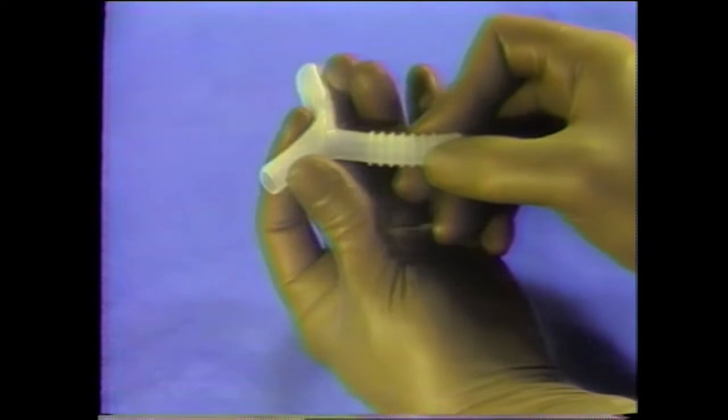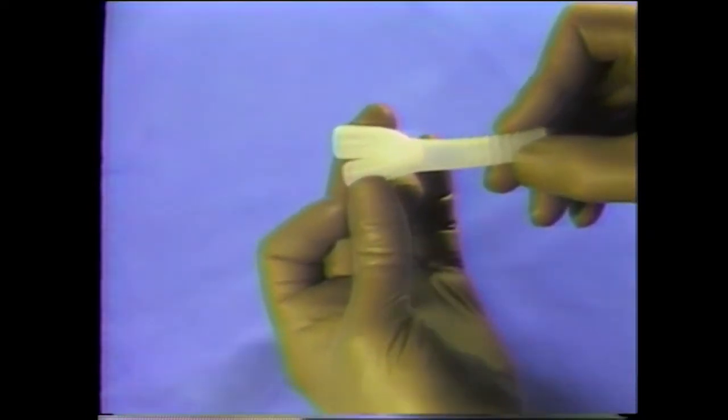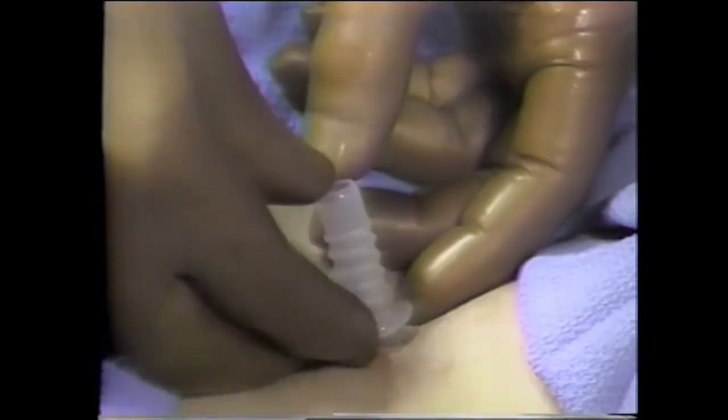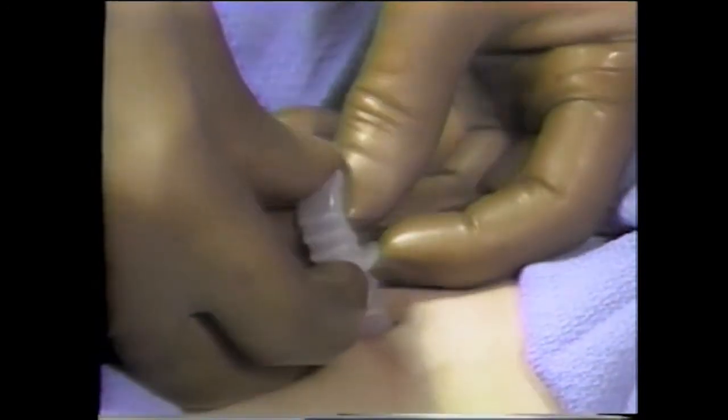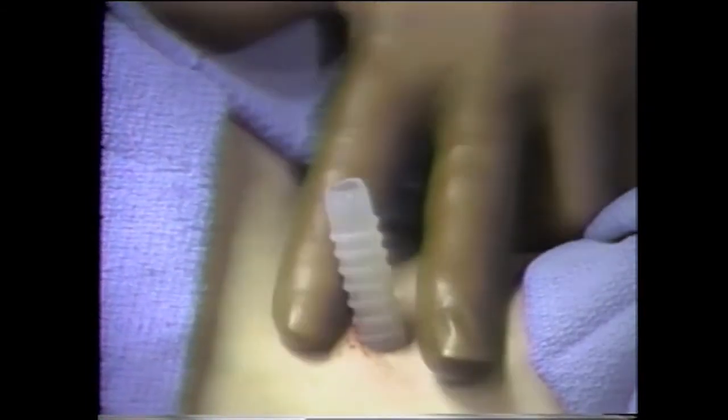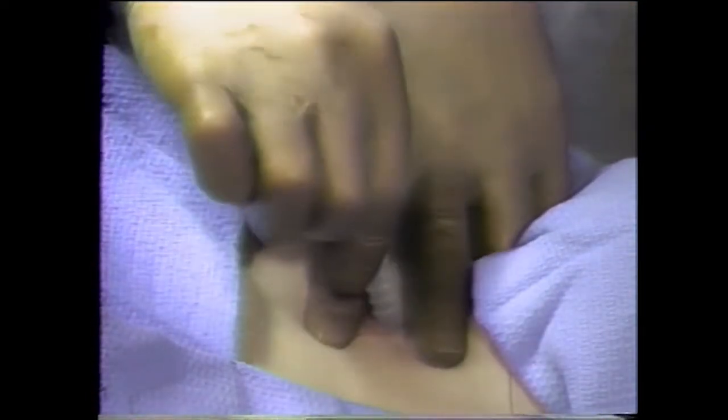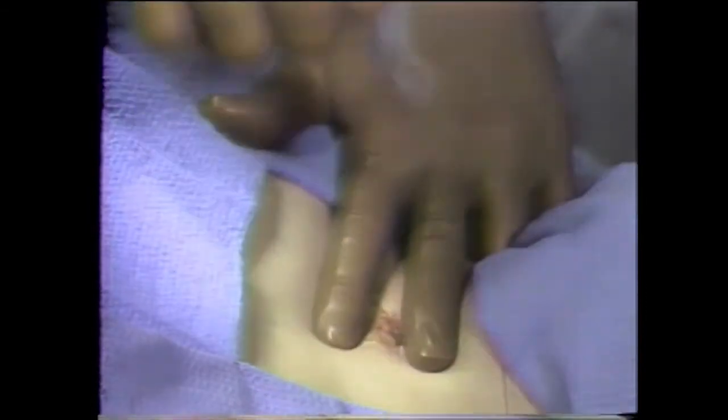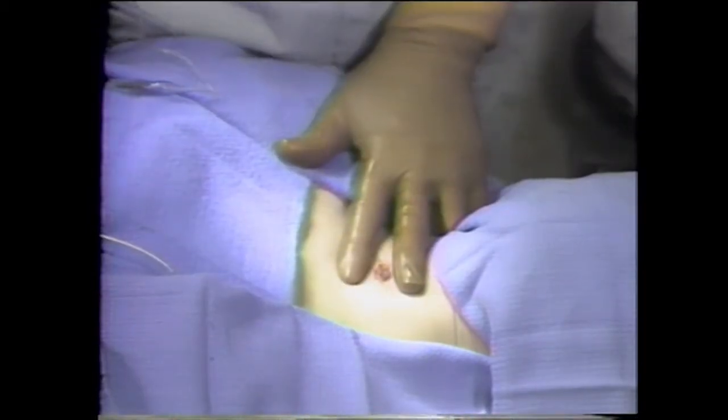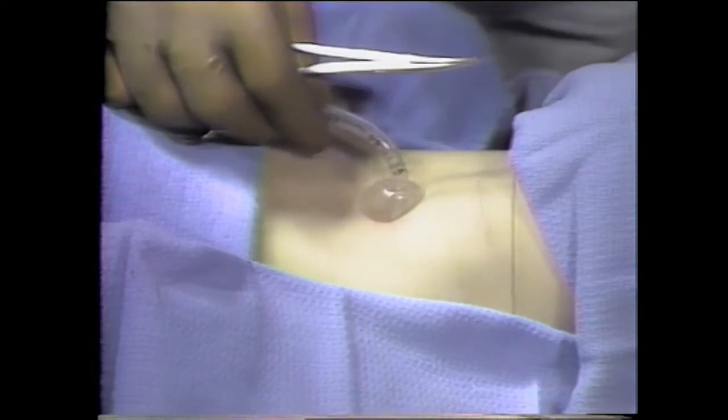As the safety tube is pulled from the trachea, the upper and lower intraluminal limbs buckle towards each other. It instantly springs back to its original shape. The ring washer is removed from the external limb of the safety tube. A finger is placed above and below the extraluminal limb of the safety tube and firm pressure is exerted posteriorly. The external limb is pulled anteriorly. An endotracheal tube is inserted as the patient recovers from general anesthesia.